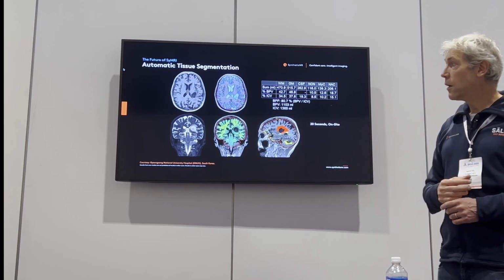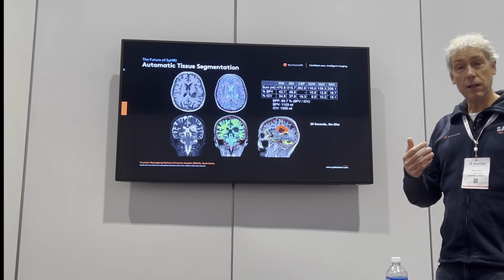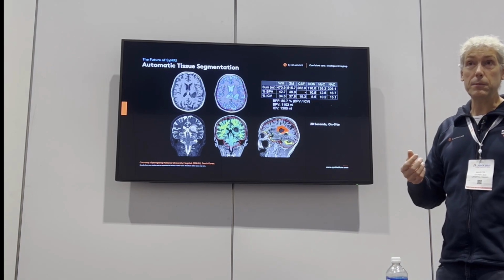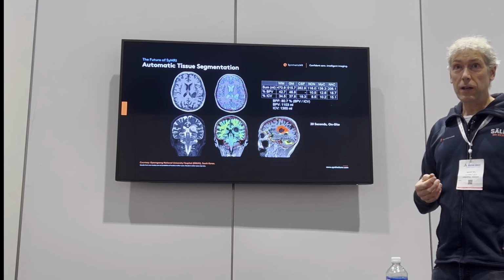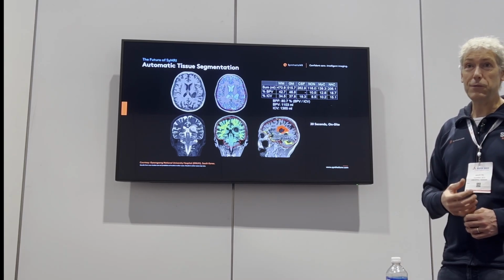And now with the FDA, it was kind of interesting. Of course, we have repeatability measurements, but we scanned a couple of our personnel again, and they failed our repeatability requirements because their brains got too small. They were smaller by more than 0.2%, but that's actually what happened. It was for real, because that's what happens if you get a little older.